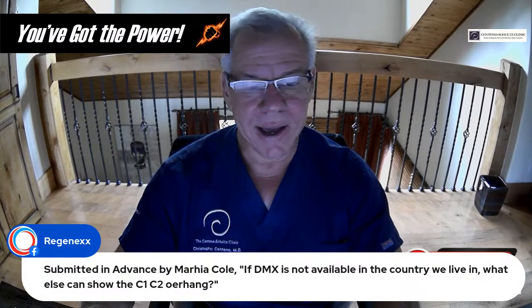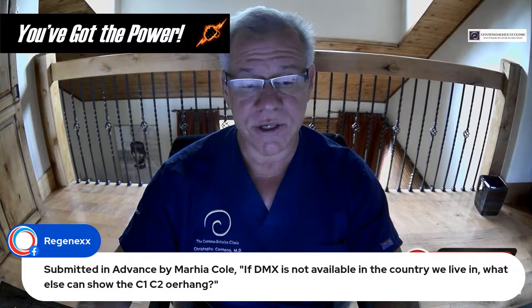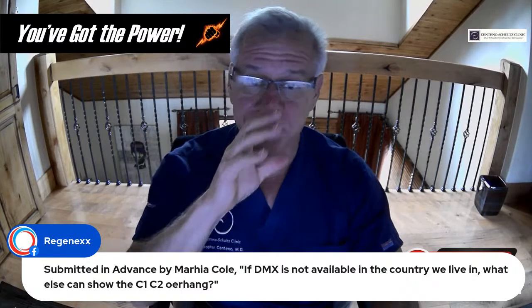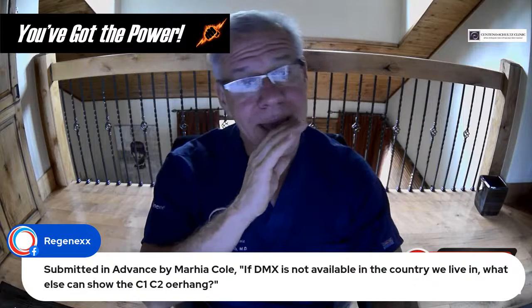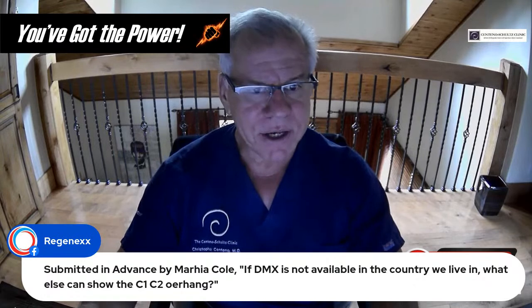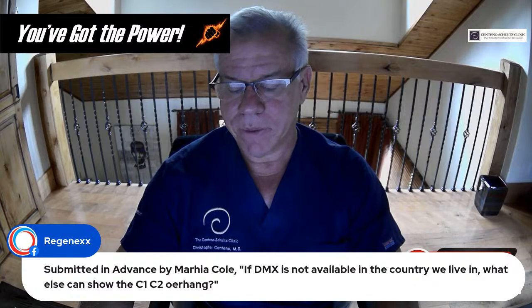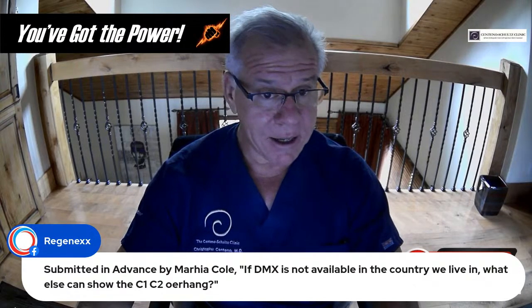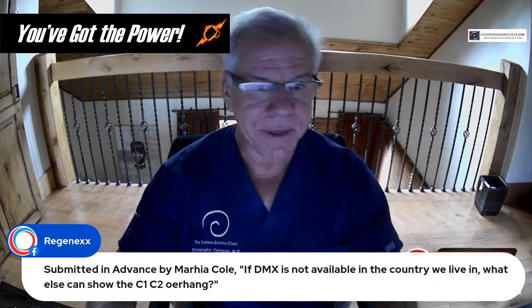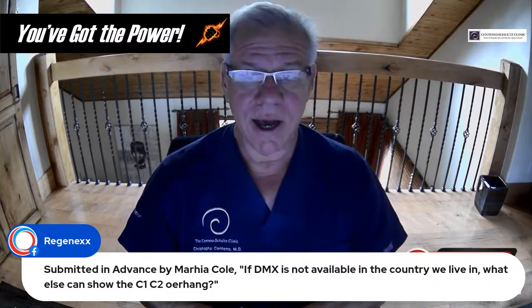Maria Cole asks: if DMX is not available in the country we live in, what else can show C1-C2 overhang? We've seen a lot of patients in Europe. They get an open mouth view, and then they do maximal lateral bending. Since this question comes up a lot, this coming Monday I'm going to try to do one of these on that topic: how do you get something like a DMX done if you're in a country that doesn't have DMX?